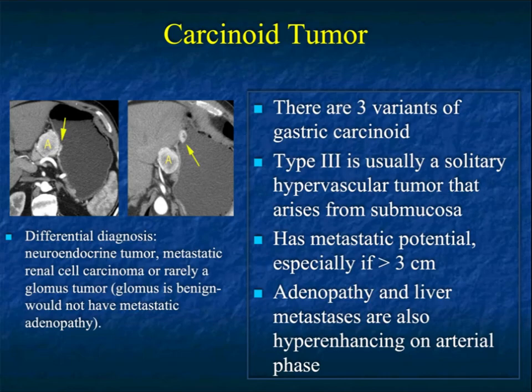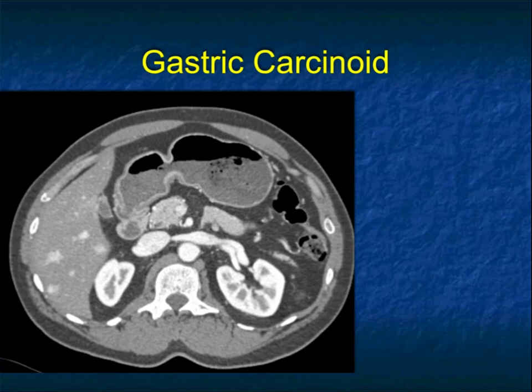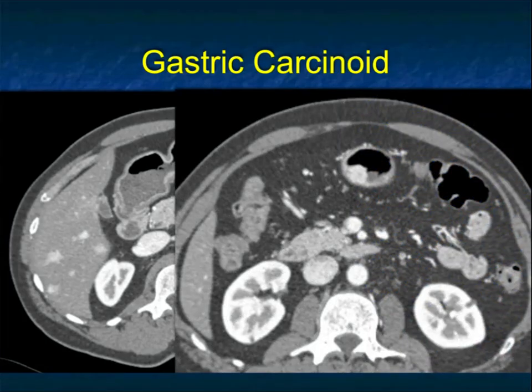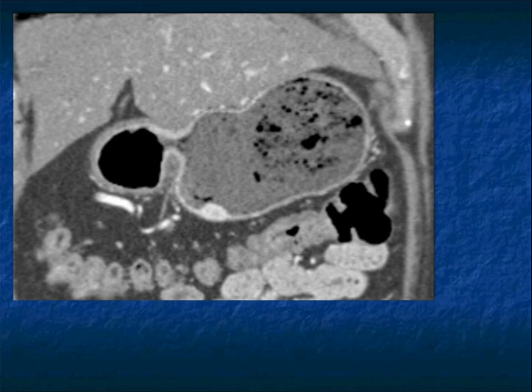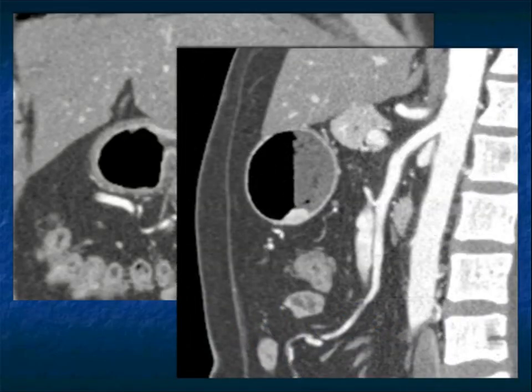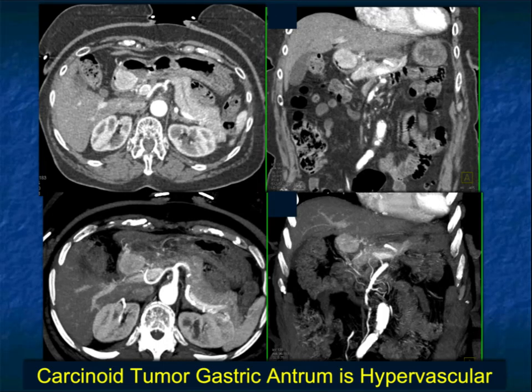Here's a nice example showing that with gastric carcinoid tumors you can see liver lesions, but the tumor can be only a centimeter. Vascular gastric lesion — there aren't that many things it could be. Glomus tumors and metastatic renal cell are possibilities, but the kidneys look great here, so a gastric carcinoid tumor is what you want to be thinking about. The coronal view is very helpful, showing the lesion sitting on the greater curvature of the stomach. Carcinoid tumors of the gastric antrum are always hypervascular — this was a nice mass in the antrum, and because it's vascular you think about a neuroendocrine tumor; in fact, this was a carcinoid. Just a beautiful example, and here's that same case with cinematic rendering.